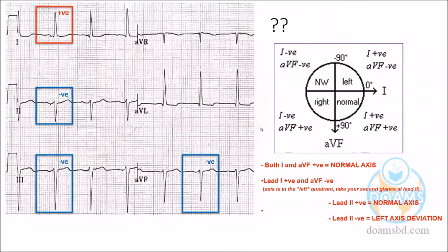Now here, look at this and give your answer, anyone, please. Already I have given the clue here. Compare this. What could it be now? Which axis deviation, or normal or not? Dr. Ibrahim is ready. Anyone? We are expecting another doctor also. Sorry, Dr. Sharmin maybe has an audio problem. No more, so Dr. Ibrahim, please, your chance.